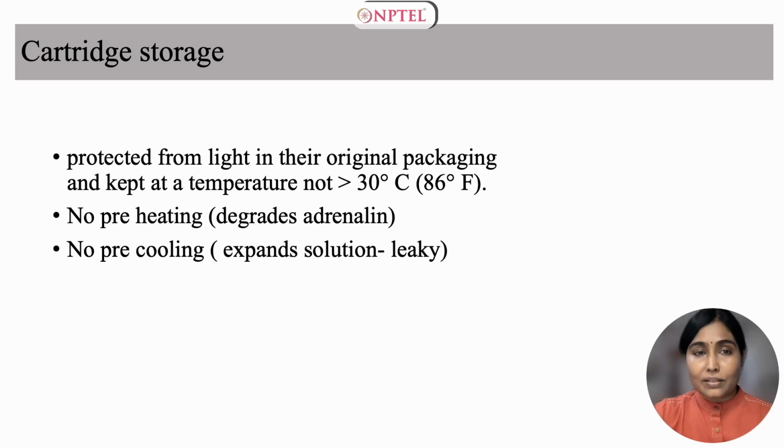Similarly, it is not advisable to refrigerate or freeze dental cartridges. The mechanical effect of cooling or freezing could cause the liquid inside to expand, causing leakage or material integrity problems. If this occurs, the solution may become unsterile and unsafe to use for injection.